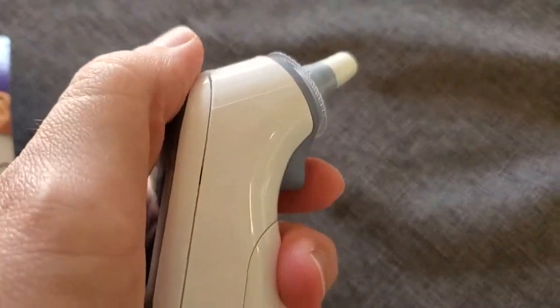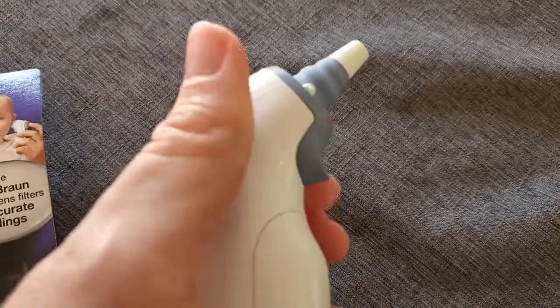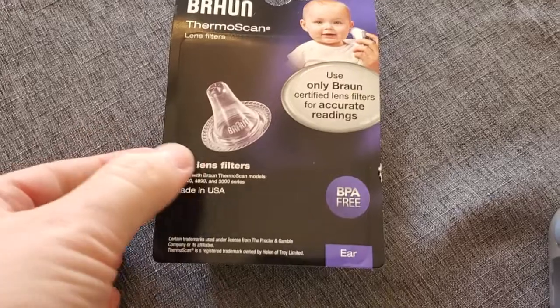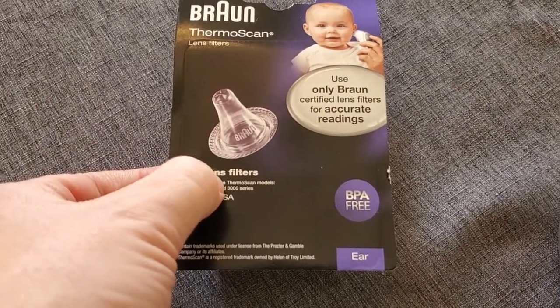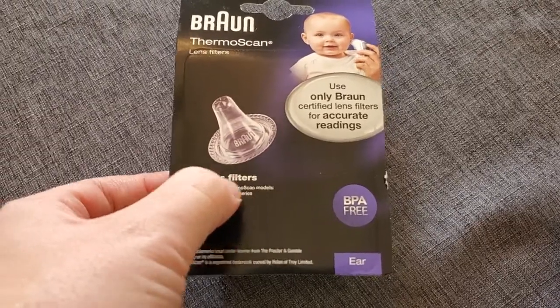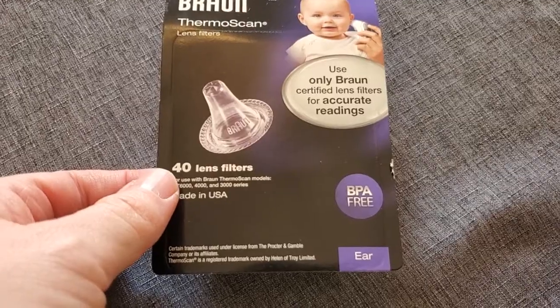Ejecting the old one is super easy — you just press the little button on the back there, it pops it right off, and throw that away. Now we're going to put a new probe cover on. They call them lens filters, which is a little bit confusing, but it's just a BPA-free cover that goes into the ear and covers up that end of the thermometer.